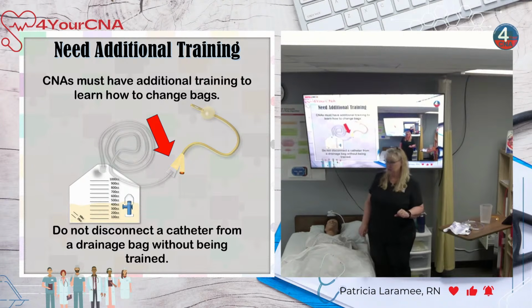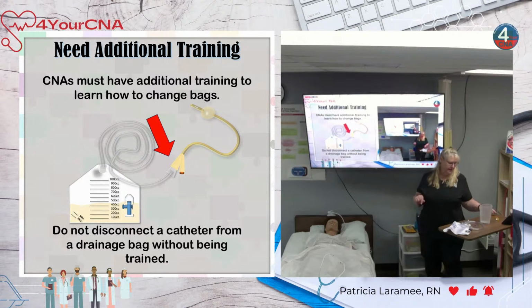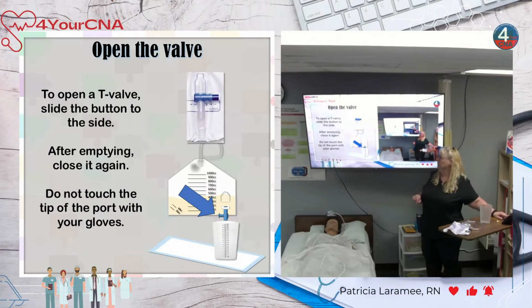Are we allowed to do that? No, we do not disconnect the catheter from the bag. Does that make sense? Unfortunately, a lot of people do that in the exam. We don't do that. That's why I keep saying you have to have additional training for that. And even with additional training, you separate them just long enough to put a new bag on. Okay, we don't take the bag to the bathroom.